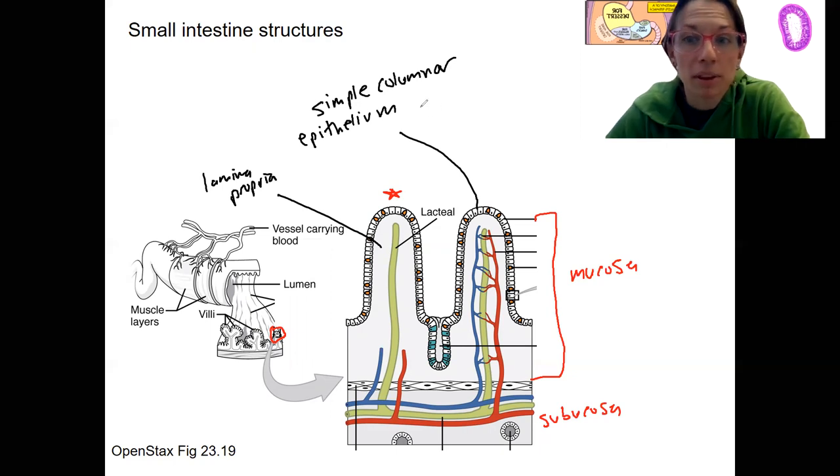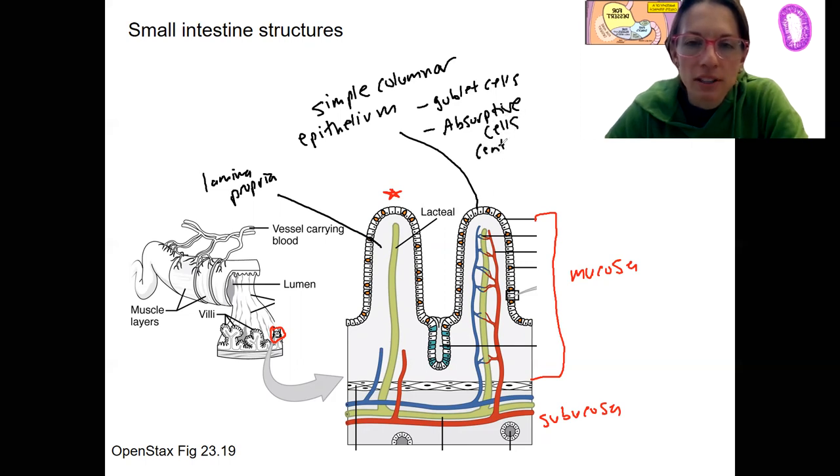Our simple columnar epithelium has epithelial cells. Some of these are goblet cells. That's these orange ones here. And some of them are absorptive cells, also called enterocytes. What do you think these do? They are going to absorb nutrients.